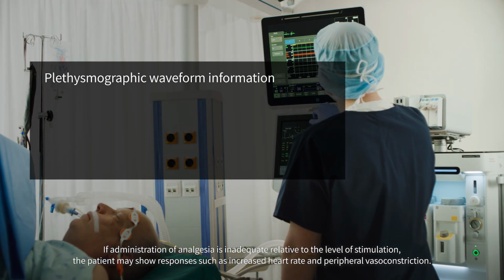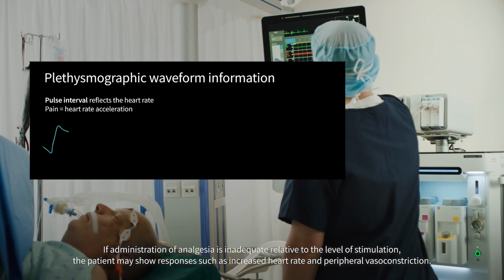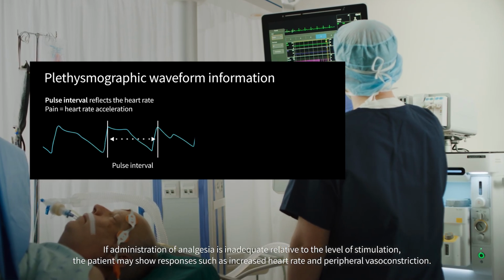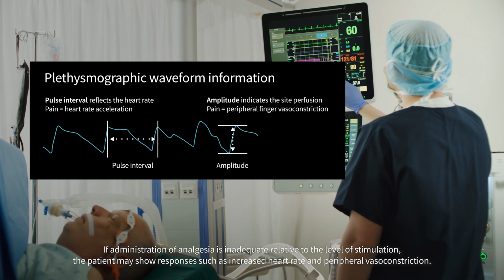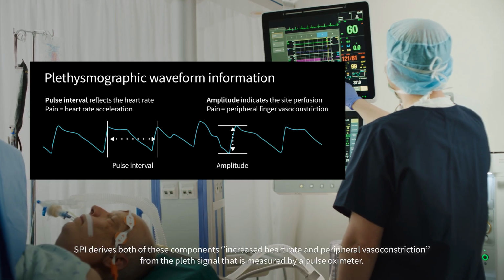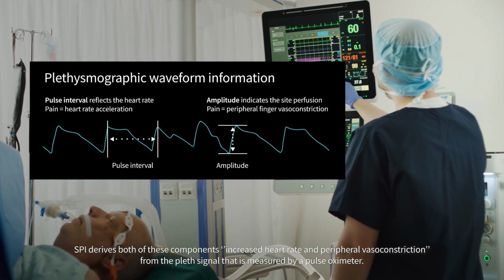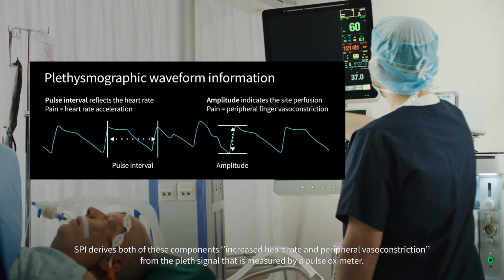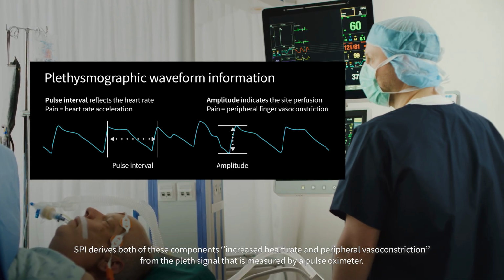If administration of analgesia is inadequate relative to the level of stimulation, the patient may show responses such as increased heart rate and peripheral vasoconstriction. SPI derives both of these components, increased heart rate and peripheral vasoconstriction, from the Pleth signal that is measured by a pulse oximeter.